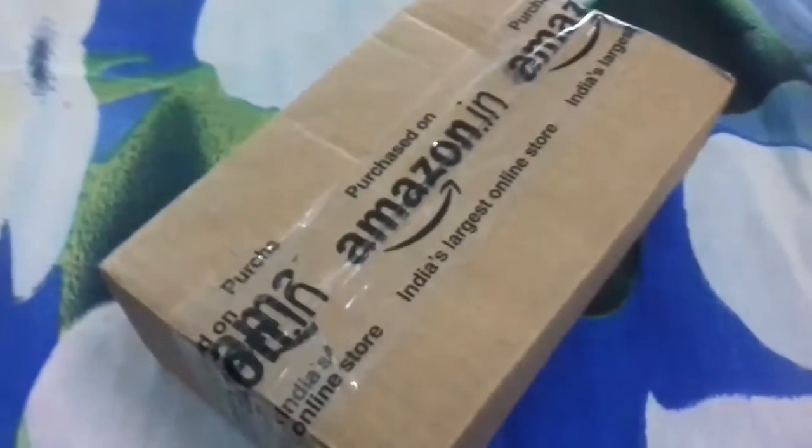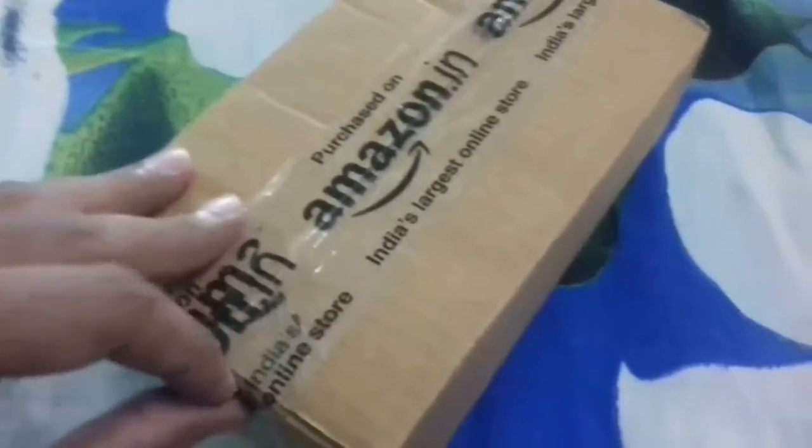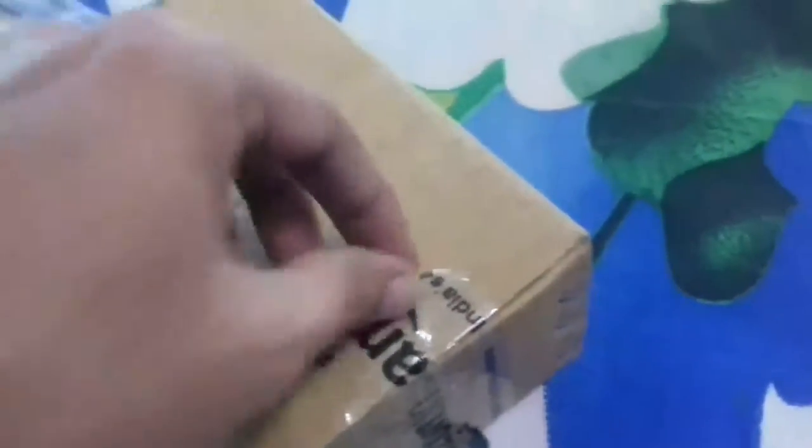I opened it earlier to check the contents of the box. If you want to order any instrument from Amazon, I will show you what we get. This is the instrument — it is fully packed in air-bubble polythene. You can see and hear the bubbles.